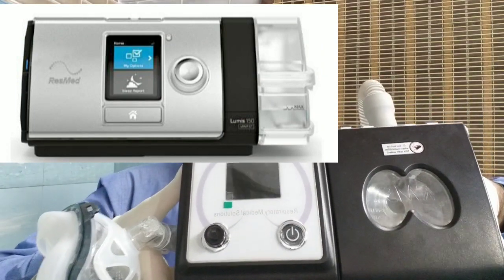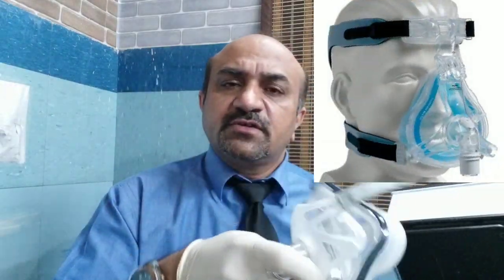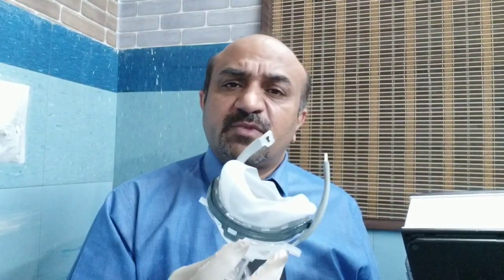Now this is a BiPAP machine. It is connected with the humidifier, and we can put the patient on it with the help of this interface, which is a naso-oral face mask. In the world nowadays, the most important interface being used between the patient and the machine is the helmet, because the helmet helps to decrease or minimize the transmission of the coronavirus from the patient to the professionals and healthcare workers who surround the patient in order to manage the patient.